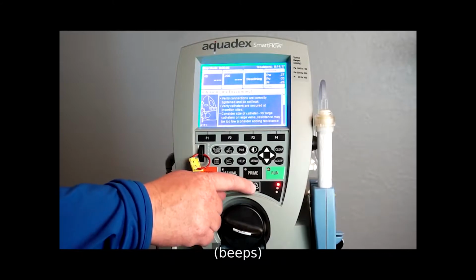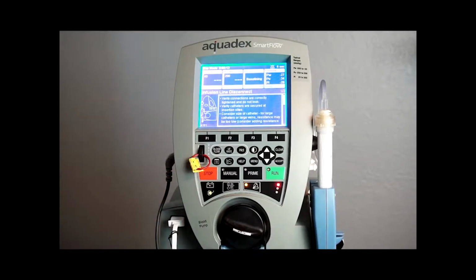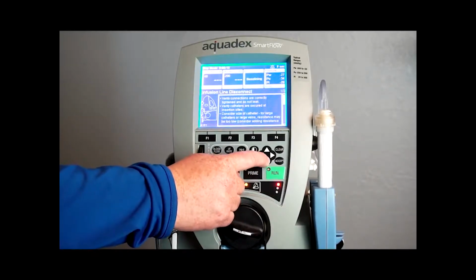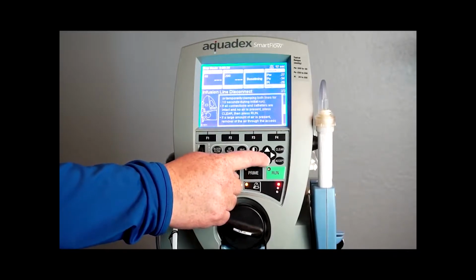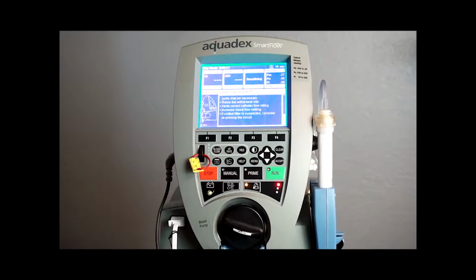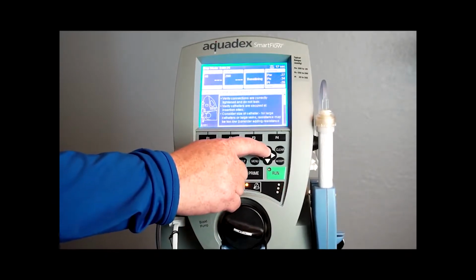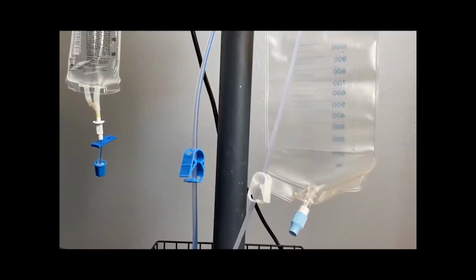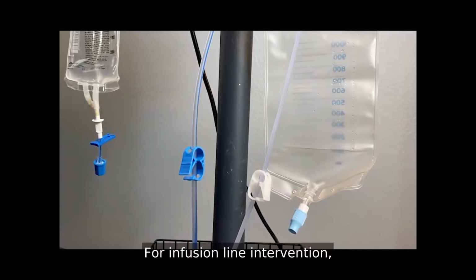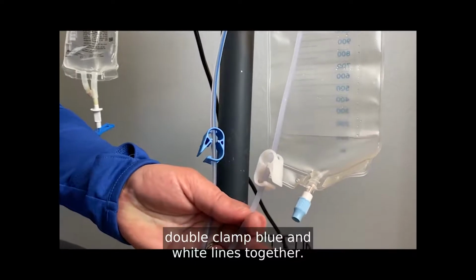Press silence. For infusion line disconnect, read interventions. For infusion line intervention, double clamp blue and white lines together.